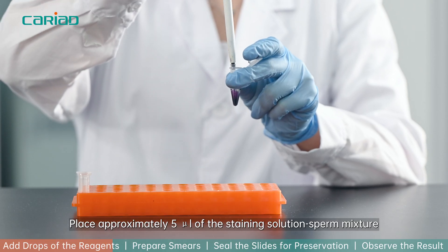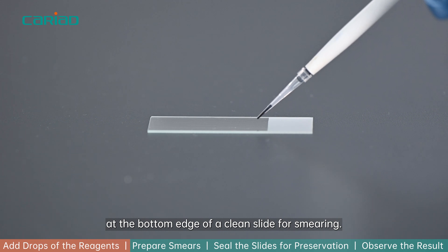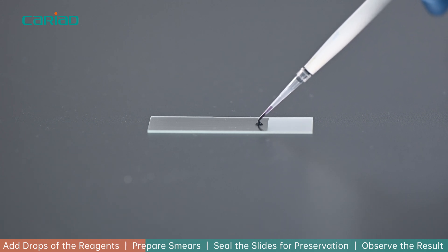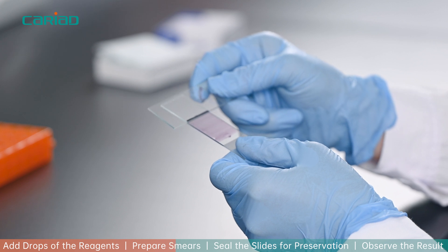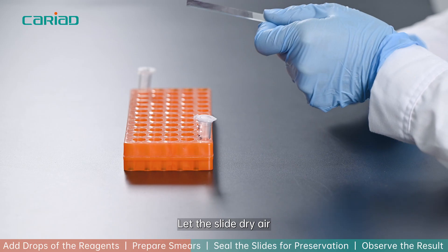Place approximately 5 µL of the staining solution-sperm mixture at the bottom edge of a clean slide for smearing. Let the slide air dry.